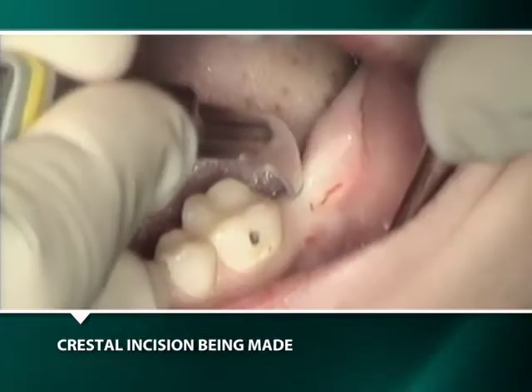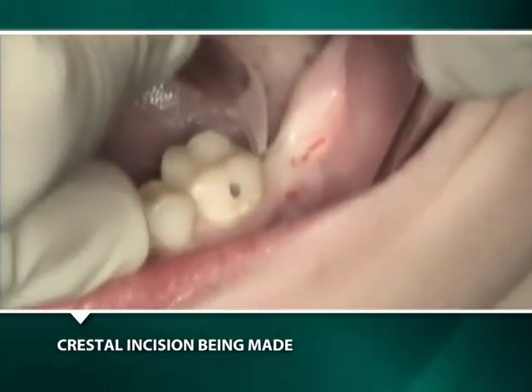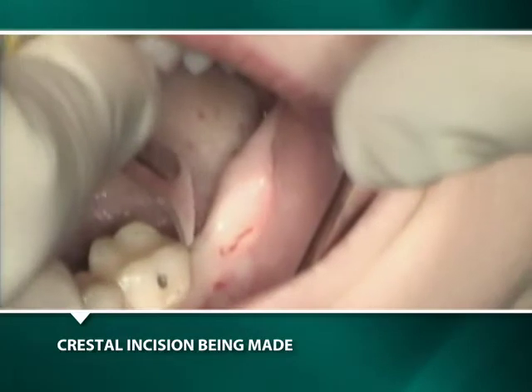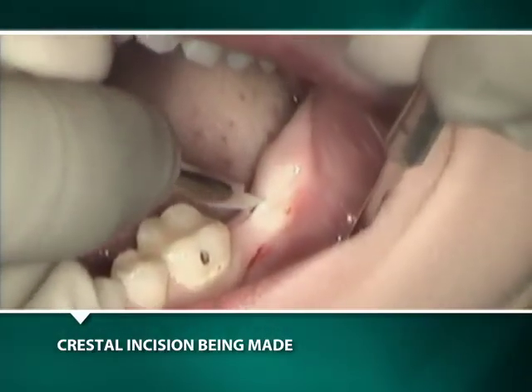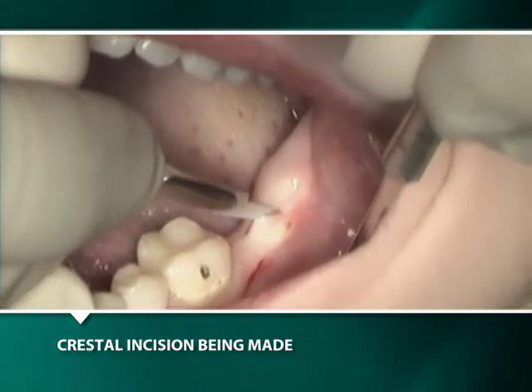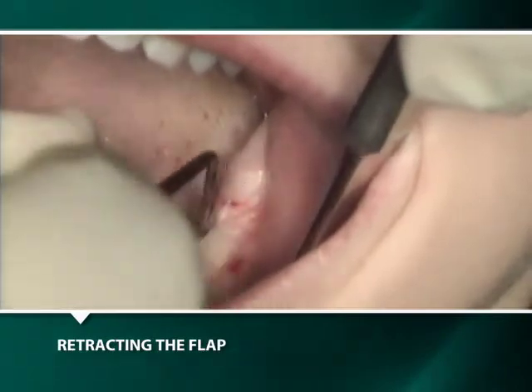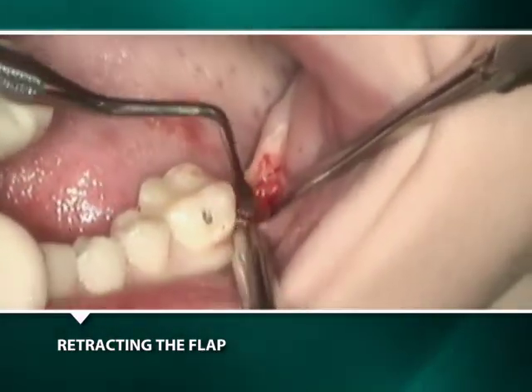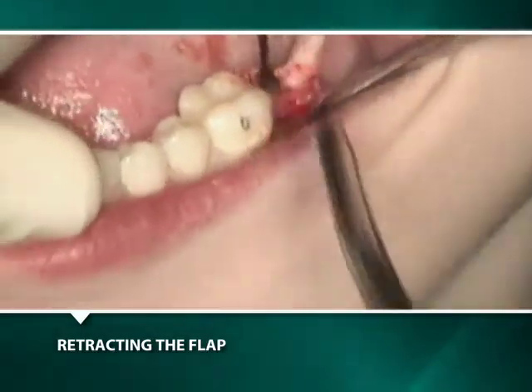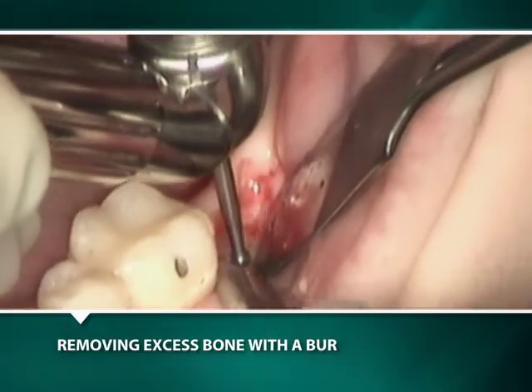After three months of healing, the implant is uncovered with a crestal incision cutting mesially until contact with the molar is achieved. A second incision is made with a slight buccal orientation to avoid risking contact with the lingual nerve. An angle curette is used as a periosteal elevator to reflect the flap. Since the black healing plug is not visible, the number four round burr with copious irrigation is used to remove its overlying bone.